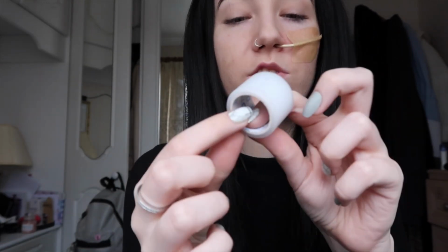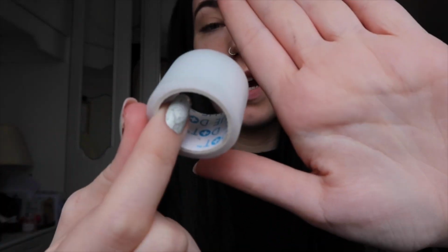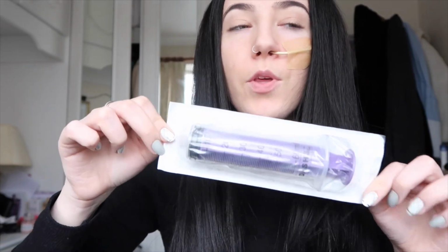You're going to need some sort of tape, so you can either use Duoderm, which is what I have on my face at the moment, or I've just got this just for this video, because usually I don't keep my NGs in that long, so I don't really need to put Duoderm on there. This is just Blue Dot, I don't know, it's just the tape that you get at the hospital. You're going to need a syringe. You can use smaller sizes, preferably bigger ones like this are the best.